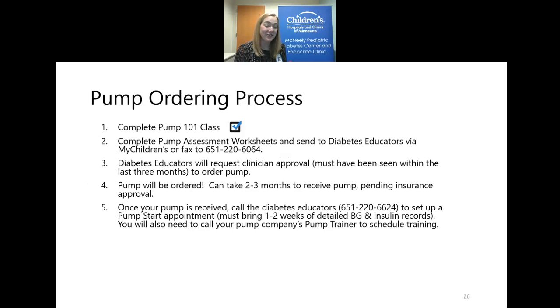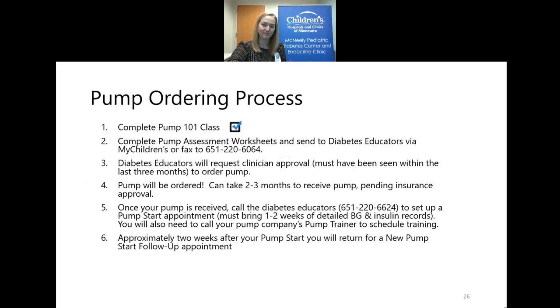And then after that, you'll also want to contact your pump company, find out who your pump trainer is, and they will train you physically on how that pump works, get you started. All right, after you start your pump, you're going to follow up with us 2 to 4 weeks to make sure that pump is going okay. As we talked about in the last slide, there can be a lot of glucose variability after starting a pump. So we want you to come back within that first month to make sure things are going okay and we can make some dose changes.